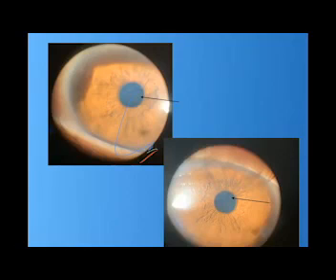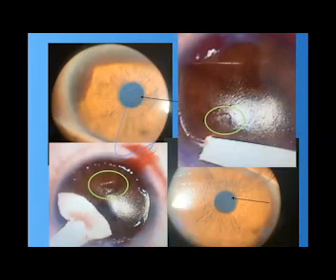The cornea is not thin, the cornea is not weak, but the corneal surface is irregular, and so we can go for refractive surgery. But I have done a flap. When I created the flap, I captured this image for you. Look here at the green circles. You will find the scar. These are the points of scarring, which are removed with a flap.